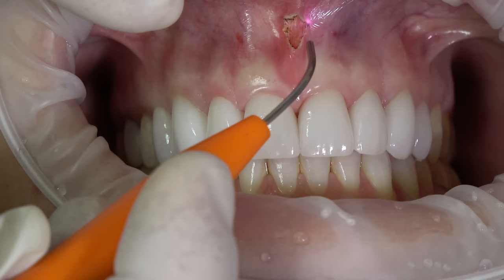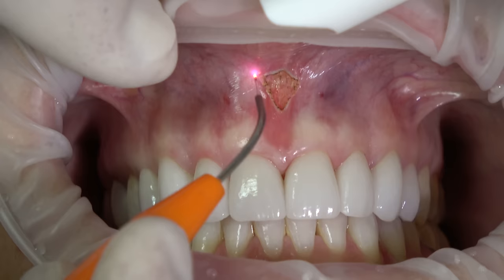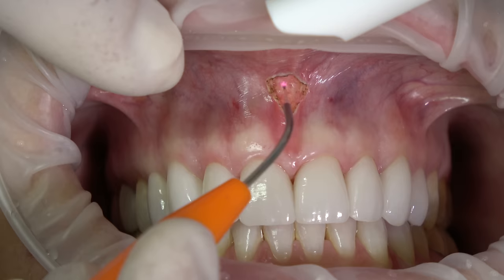You can see we have minimal char, yet it's cutting very efficiently. This is an end-cutting laser. My goal with this is to go completely through the fiber until I hit periosteum.